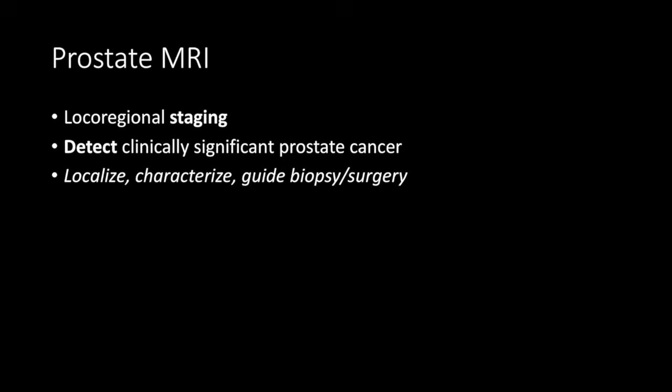With advances in technology, there has been improvement in detection of clinically significant prostate cancer with MRI. So now, it's not only used for staging, but also used to detect clinically significant prostate cancer, characterize it, and provide image guidance for biopsy or focal therapy.